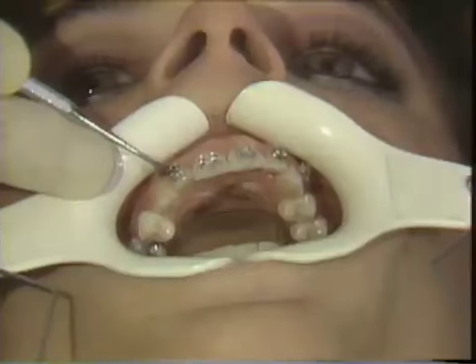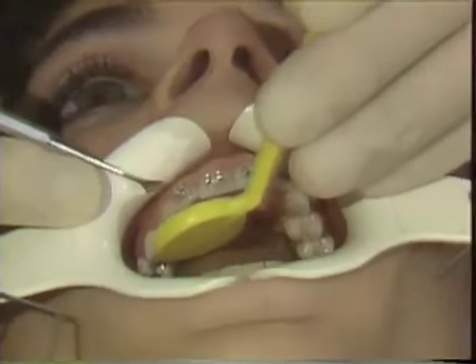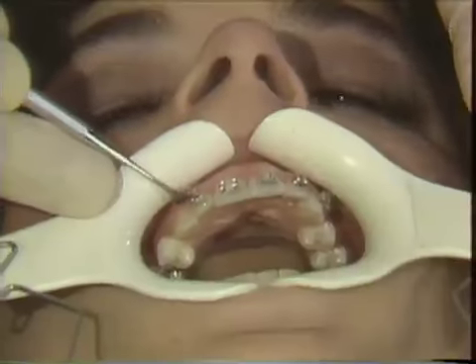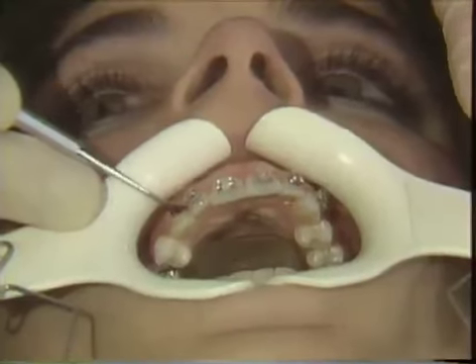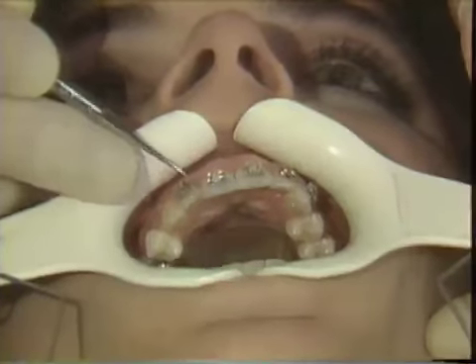Again, the bracket is positioned appropriately, position checked in the mirror. Then the bracket is pushed into place, and there's very little, if any, drifting of the bracket after it's positioned. And then we carefully clean off the excess.